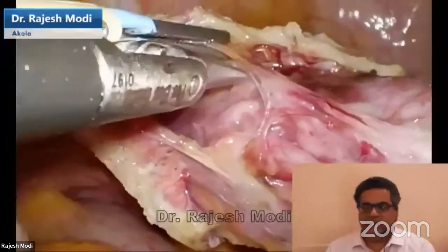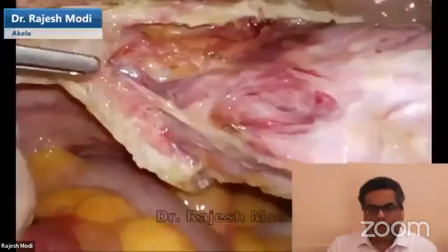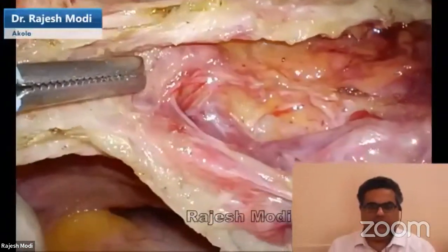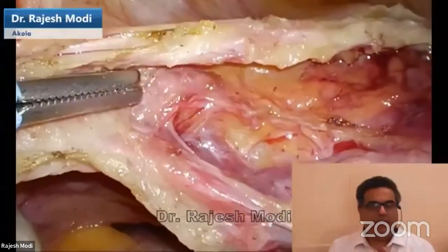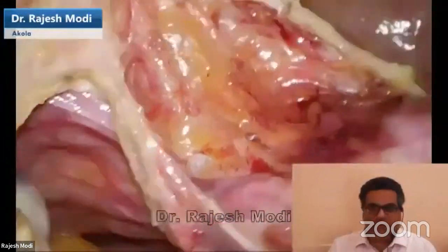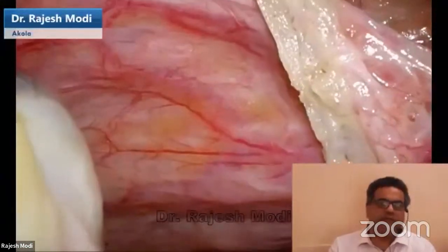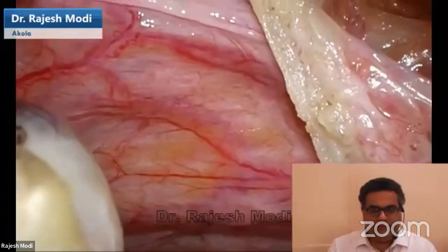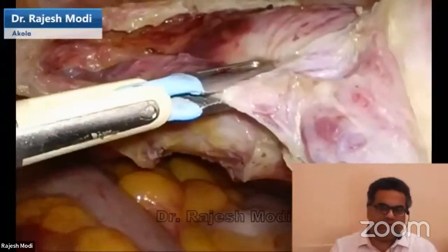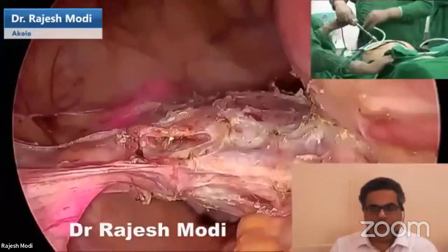So here you can again see the delicateness of your movement is what you need to develop. Buying a better machine or shifting from a vessel sealer to a harmonic is not going to improve your surgical output. But being able to control the tips of the instrument and the feel of the tissue which you get from the instrument, that is what is relevant and important. That is achieved by doing more and more surgeries. As long as you are able to enhance your surgical skill, you will not have to worry about damaging the ureter.